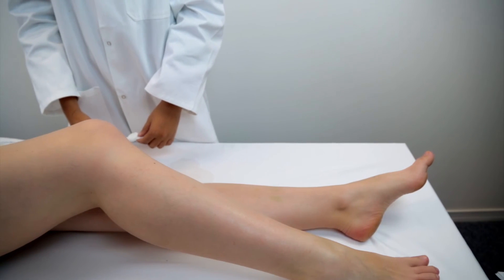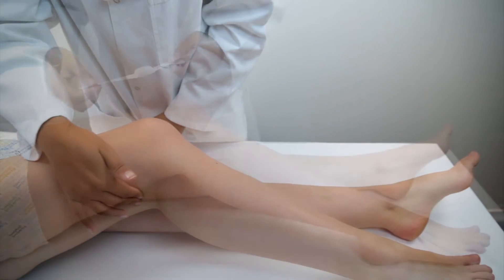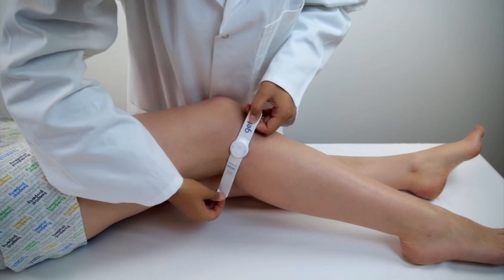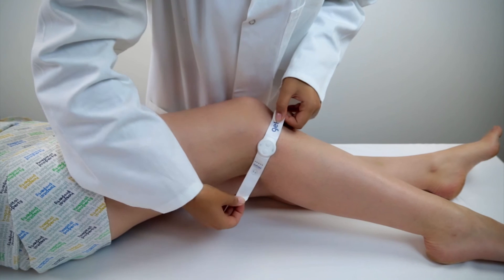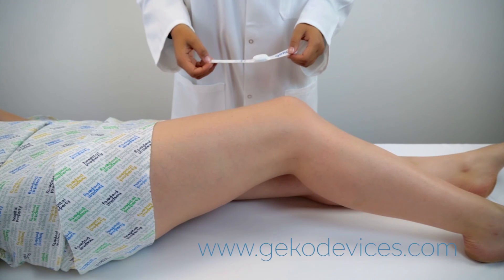Note: if the primary location does not produce movement of the muscles, stimulation may be achieved using alternative fitting locations — slightly above or below and parallel to the crease at the back of the knee, with the location marker aligned to the outer tendon. See www.gekodevices.com for further details on alternative locations.